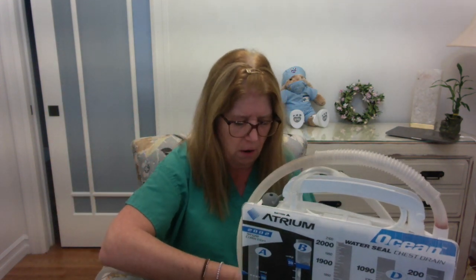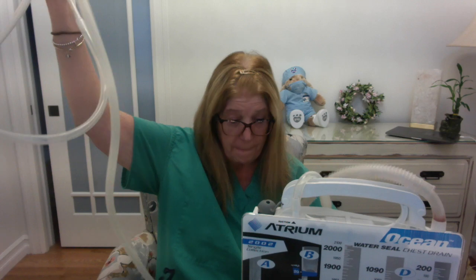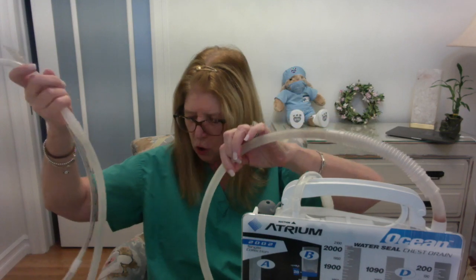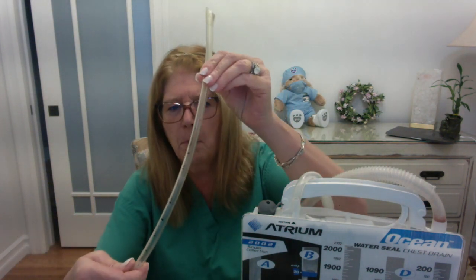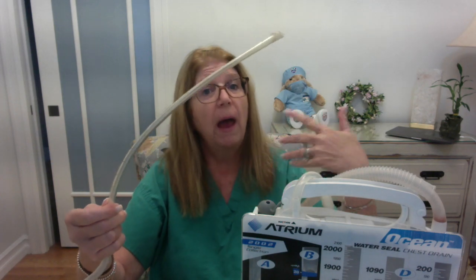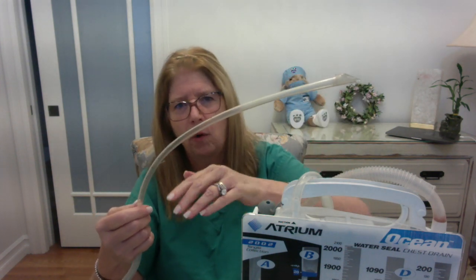So let's take a look here at the first part, which would be the tubing that is connected to the actual patient and to their chest tube. So when we are looking at these devices, I want to make sure that you are indeed seeing all of the components, okay? So I'll do my best to make sure that everything is in the picture. So first and foremost, this portion here is the actual chest tube. You'll notice that the tubing has markings on it, right, for centimeters. That tells you how far the tube is into the patient's chest, and that would be something to assess, right, to make sure that that tube is not migrating in or migrating out of the patient.